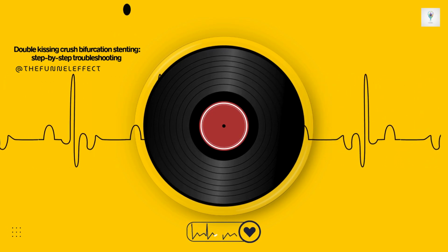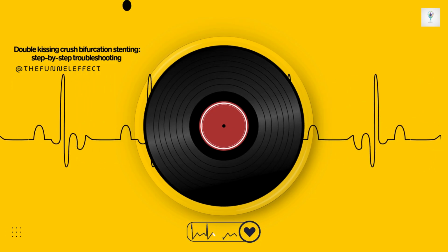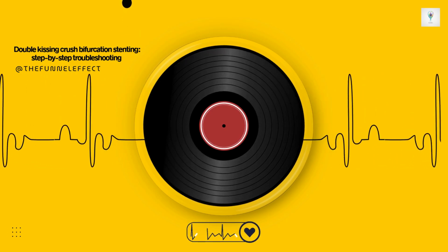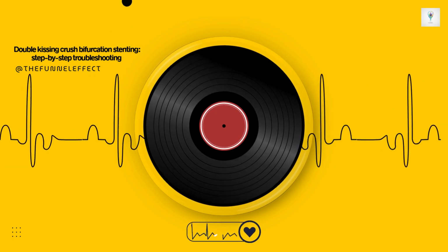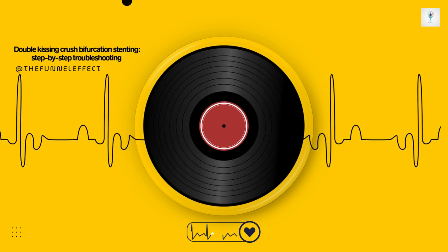It's definitely a high-risk maneuver, no question. You have to be incredibly careful. You're advancing a smooth, low-profile device, applying controlled force just where needed, hopefully. It's generally considered safer than pulling, which puts uncontrolled tension on the wire itself. It works most of the time, but requires skill, patience, and often imaging guidance like IVUS to see what's happening. It's not something you undertake lightly.